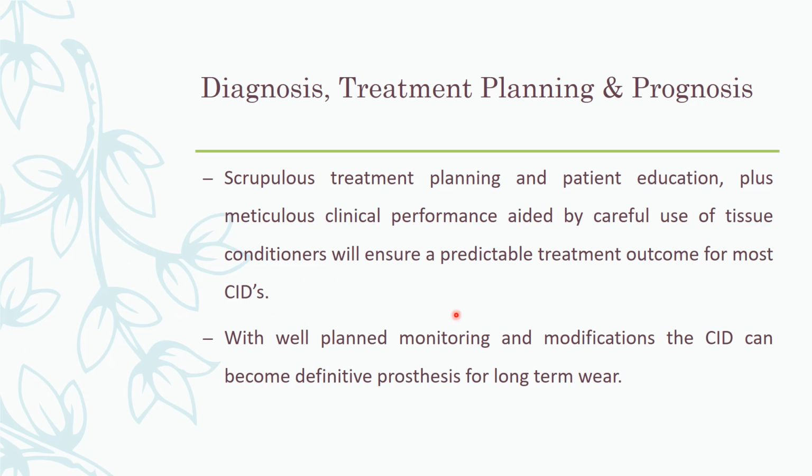A well planned and monitored conventional immediate denture can serve as a definitive prosthesis for a long term. I have done one case in my MDS times, and the patient used it for a long time. I had to reline it, I think, twice, but the patient was happy and she was using it. She was a young patient.